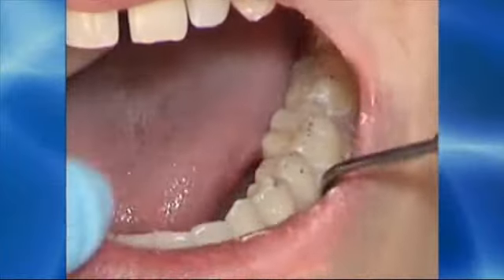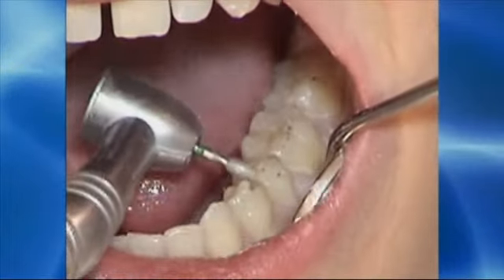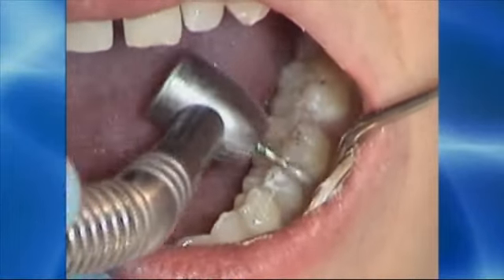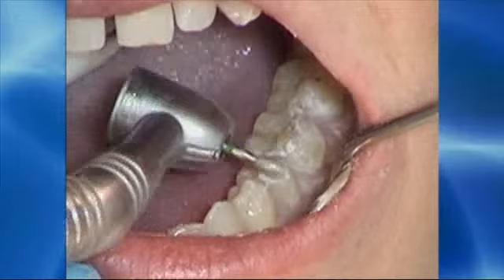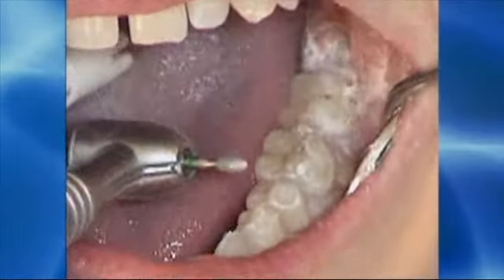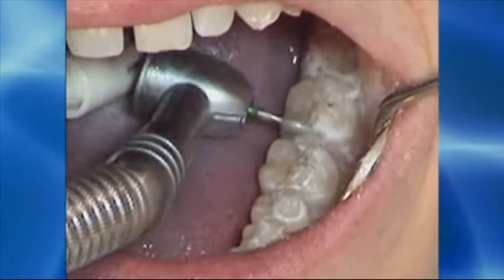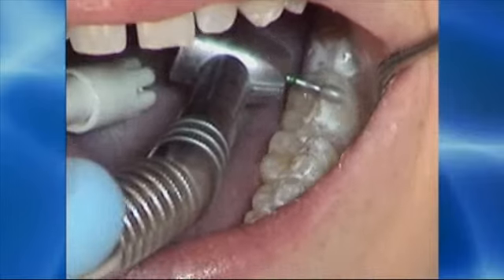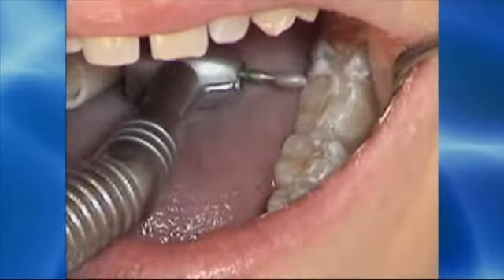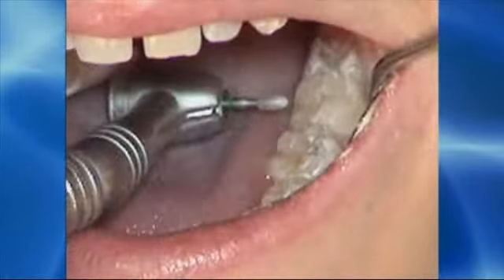The counter adjustment on the lower left, you see there's a line of contact all along the buccal cusp, but there's also still some contact down on the buccal aspects of these cusps. And you can see I'm trimming around the cusp tip of the first premolar, down on the buccal cusp of the second premolar, trying to move any linear component back up towards the cusp tip. The two molars have pretty good line of contact, just touching up the buccal surface and any scratchy little lines, inconsistent contacts. Here I'm removing a contact that's down on the buccal surface that indicates long disclusion, and a little touch up to the balancing incline on the distal buccal aspect of the second molar.